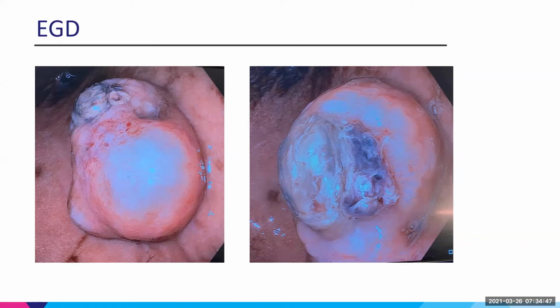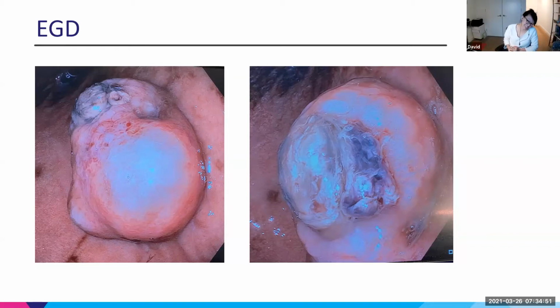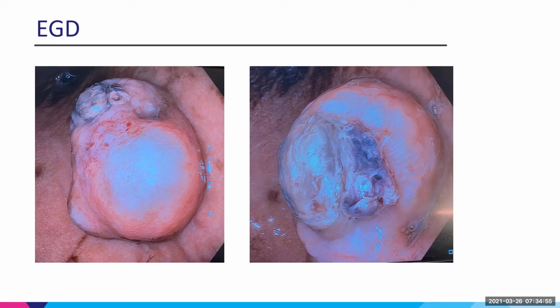So I thought that was a great presentation that you did. I remember this case very vividly, and I think your slides were great. And I would just highlight that for our patients, we can really offer a great endoscopic resection. They have outstanding results. And I think the comment Satish made was very pointed about those perforation rates really aren't perforations. You have to cut it off the muscle.